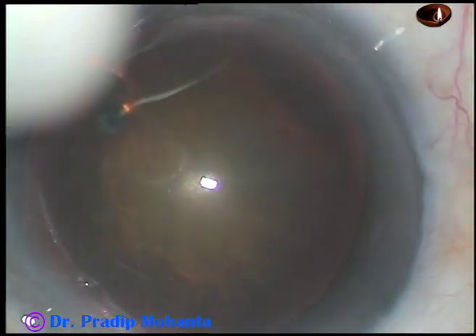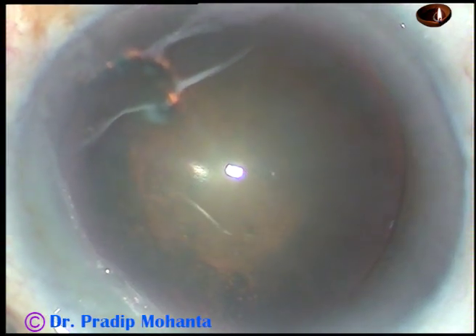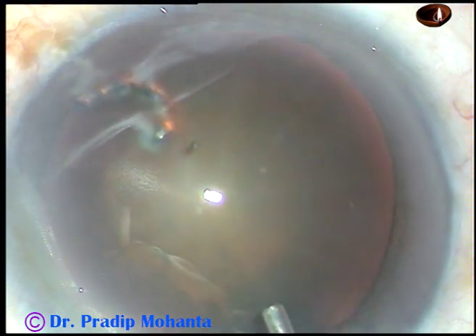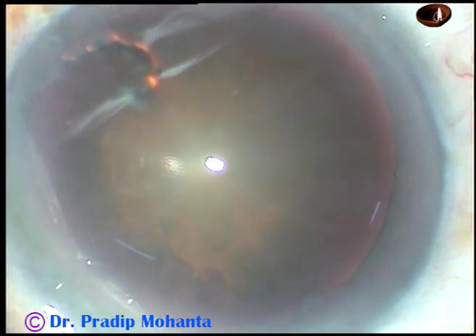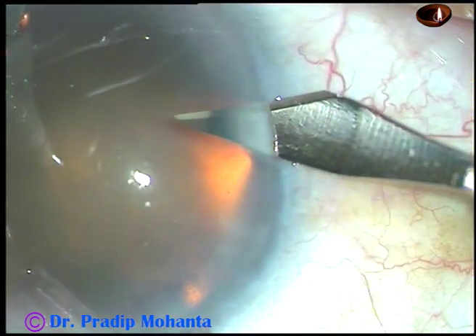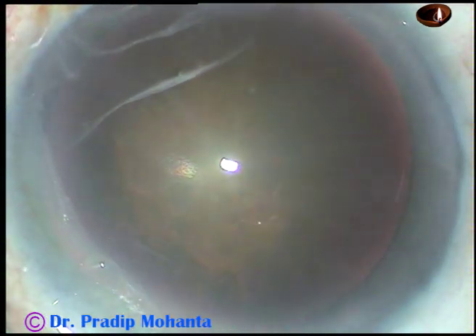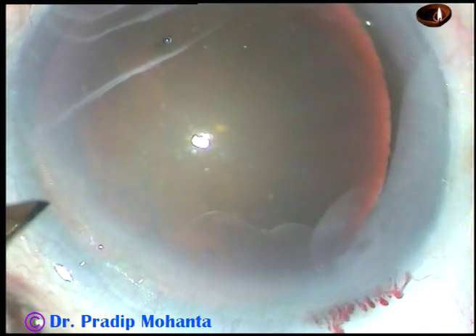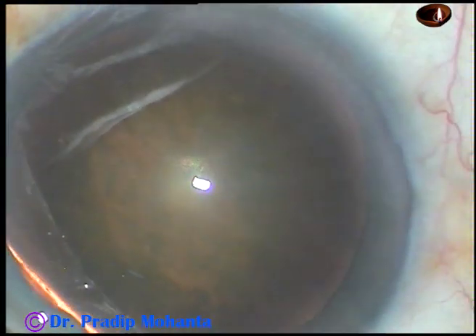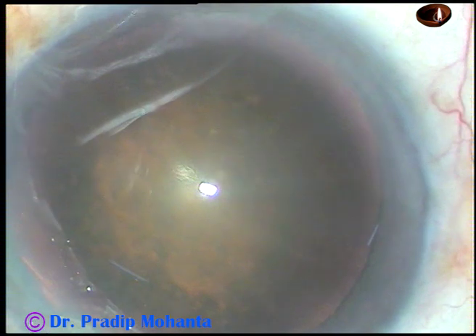This is the main incision — it's a posterior limbal incision. Viscoelastic substance is then injected into the anterior chamber. And now, this is a paracentesis on the right side of the main incision, and this is another paracentesis on the left side of the main incision.